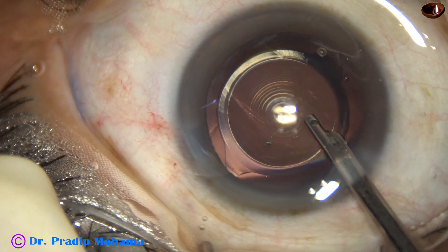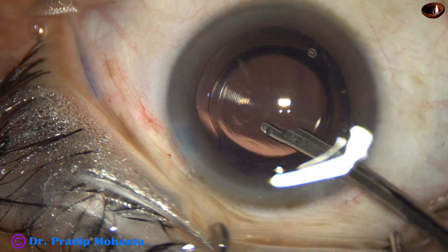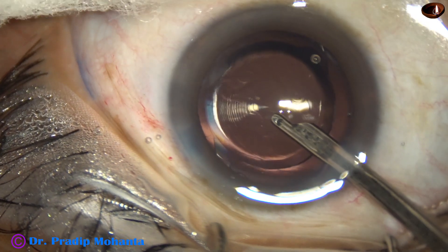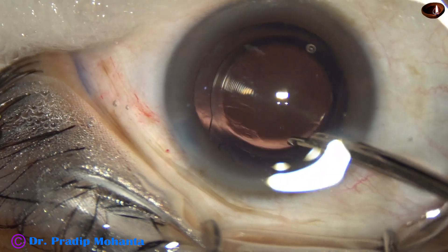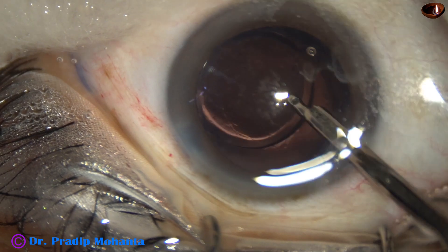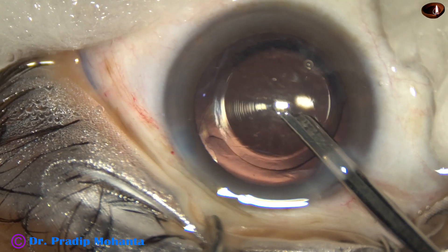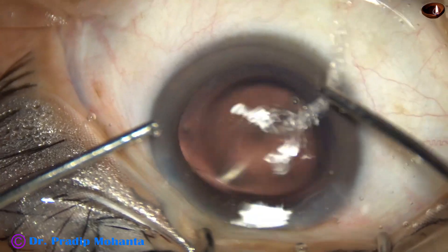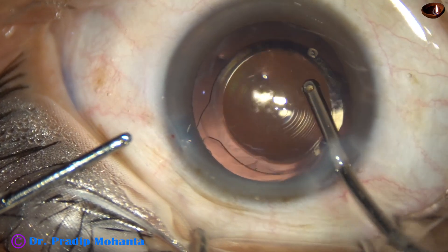And now visco is cleaned very nicely. The first irrigation by the Simcoe — I call it double irrigation — because there is irrigation and through the aspirating port I flush out some amount of visco pieces. The capsular bag and the chamber are irrigated. Then I take the irrigation-aspiration cannula.